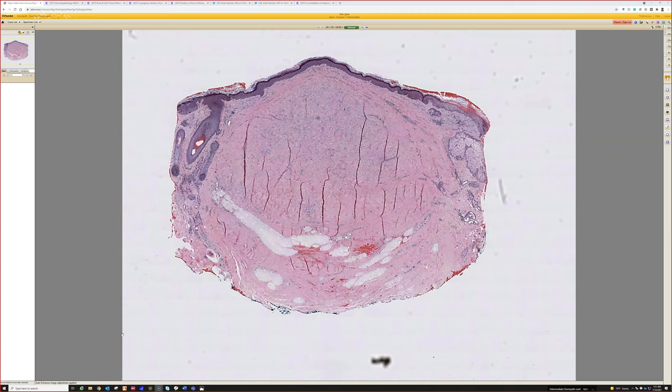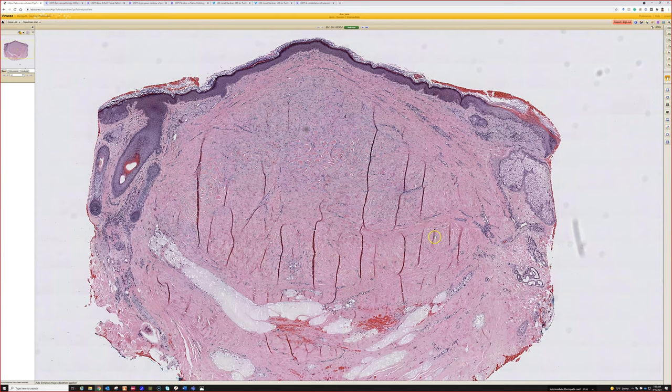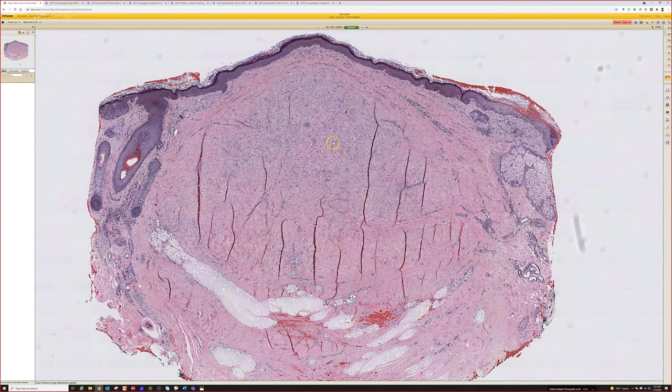So this is case one. Who wants to take this one? From skin, it looks like we're looking at a dermal process. Even from this power you can see the thick pink collagen in there. I'm thinking a keloid, with some inflammation — chronic, sort of granulomatous inflammation surrounding it as well.